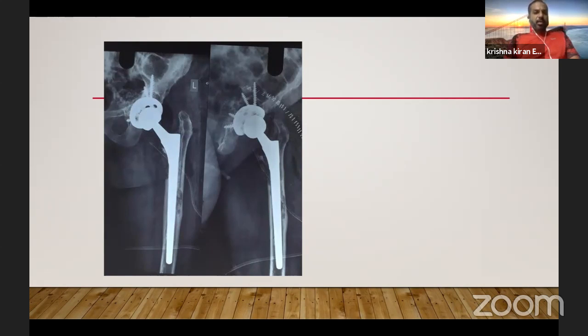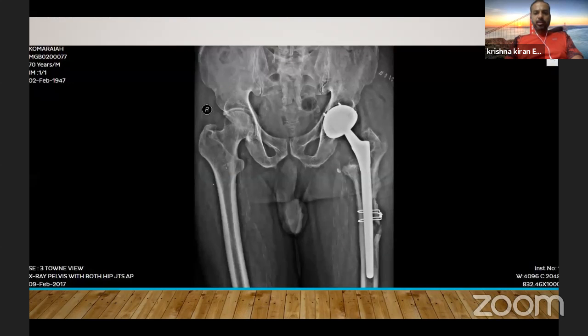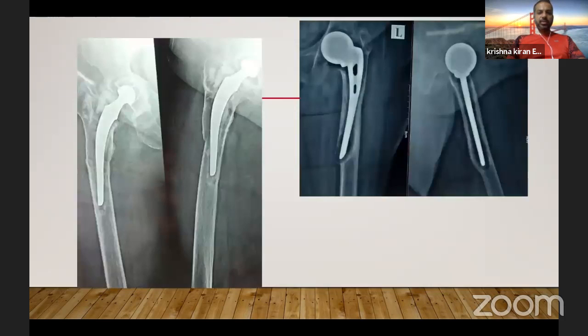One advantage of the modular titanium stem over the porous cobalt chrome stem is that if there is a proximal part of the stem which is not having bony contact, the cobalt chrome stems can fracture at that metaphyseal diaphyseal junction. So it's always a better idea to put a titanium stem like a Wagner in these situations. Another example of a 3A defect, you can see that the proximal part is almost damaged. Again, reconstructed using a Wagner type of device. 4 centimeters of scratch fit distal to the bone defect is what we want. And 4 centimeters of isthmus was available in this case for fixation.